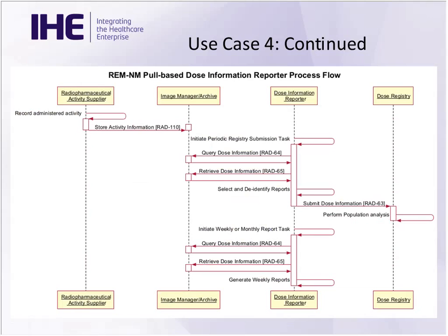This is very similar to the workflow that was already described in the RRD for the CTs and other X-ray REM, the standard REM profile.